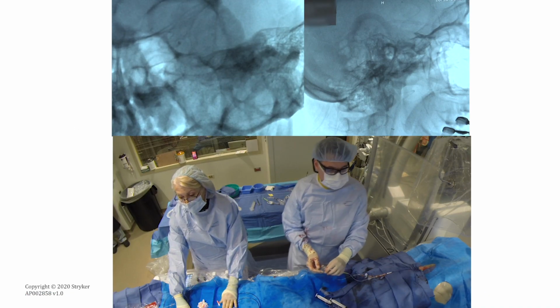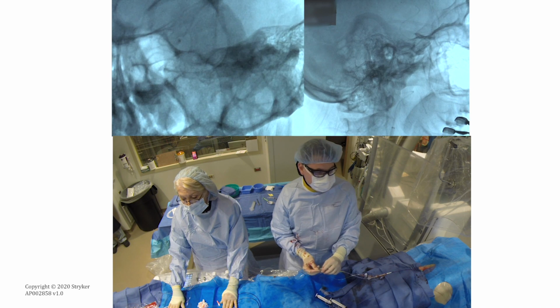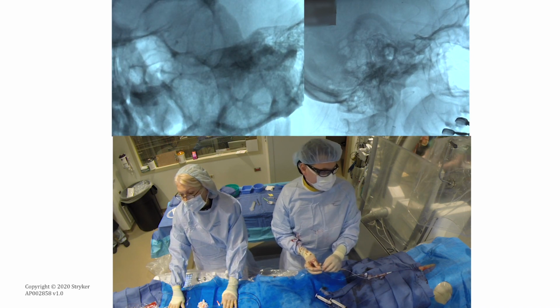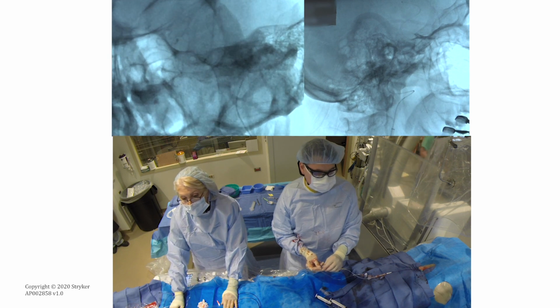and now we're about to proceed. You note that my tech here had everything ready to go as you're calling this out, prior to needing the device, and the team is prepared to hand it to you as soon as your next step is ready to go.